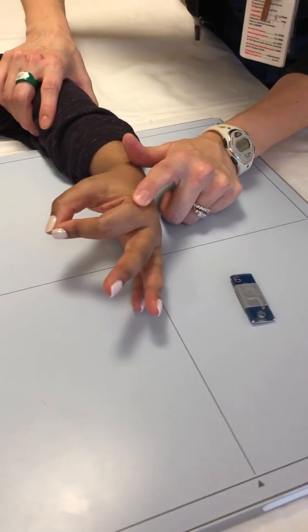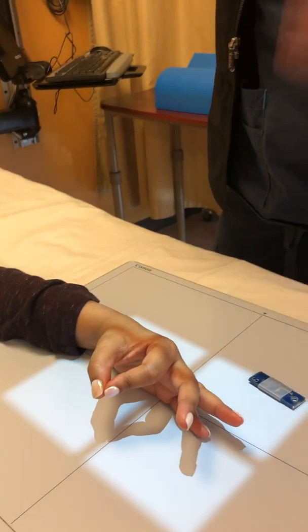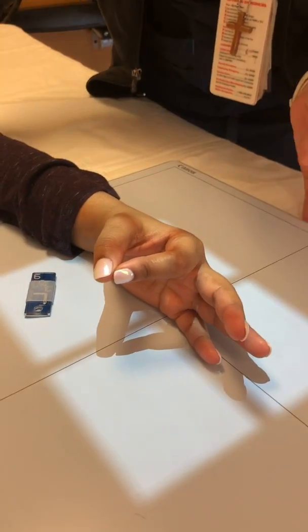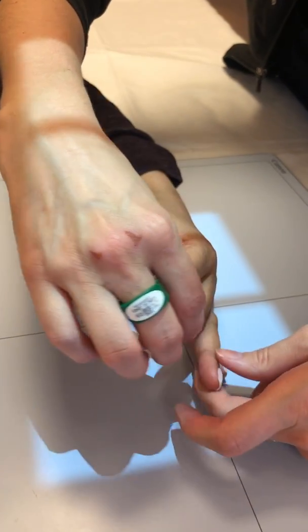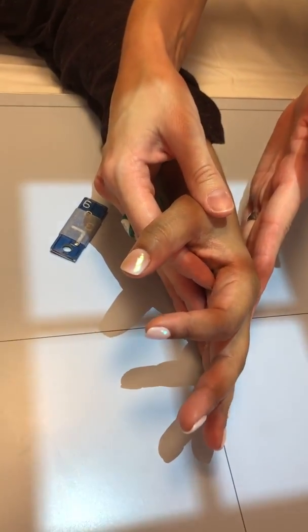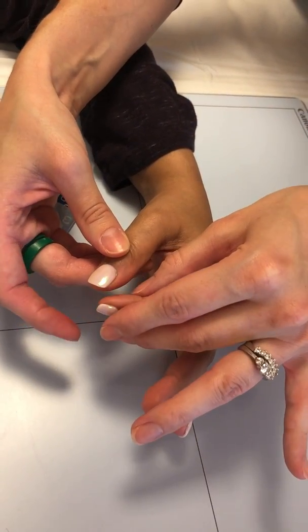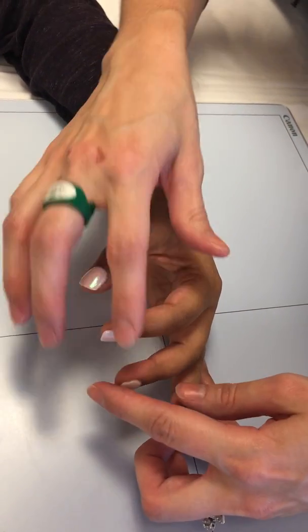Keeping the PIP joints in the center of the image, I'm going to orient my machine just like this, my light, everything. Turn my marker to the inside. And we can actually straighten your hand just a little bit. Is that okay? Mm-hmm. All right, so now what I tell them is just relax here a little bit. What's important is to make sure that you splay these fingers out, but keep these joints nice and straight. You don't want them pinching their fingers together so tight here. You'll have overlapping of the bones, so you want them nice and relaxed. It's going to open up all these little joints, and again kind of splay these fingers out just like so.